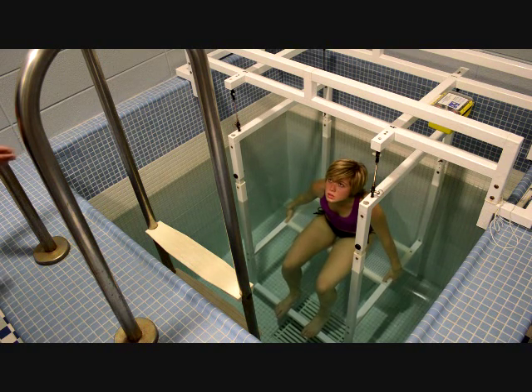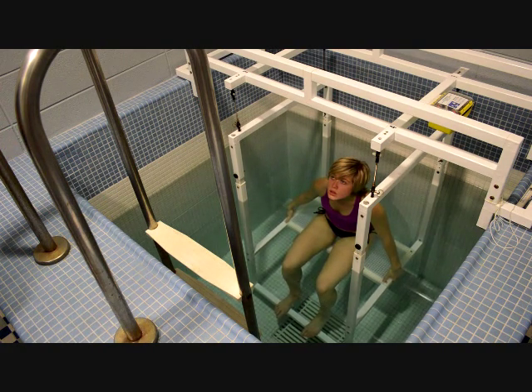Now at any point while you're underneath the water, if you feel like you need air right now and just have to come up, go ahead and come on up. There's no problem with that — you're in control the entire time. We're going to do this a minimum of three times, and after that I'll make recommendations as to whether we should go on or not.